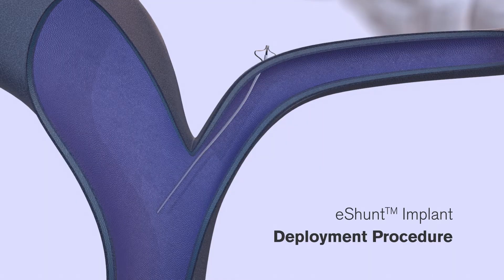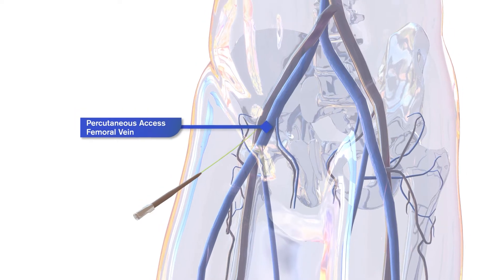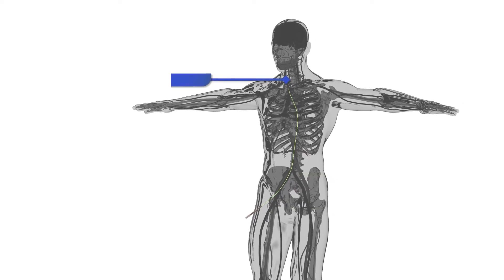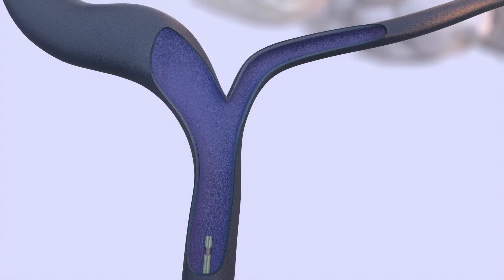We will now examine each step in the eShun procedure. Percutaneous venous access is first established in the femoral vein using standard access tools. A guide catheter, micro catheter, and guide wire are advanced through the venous vasculature and through the internal jugular vein to gain access to the inferior petrosal sinus, or IPS.